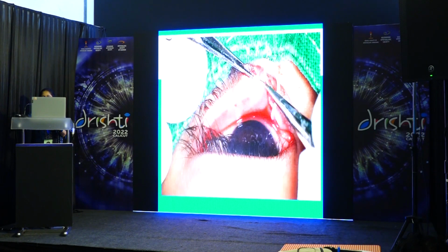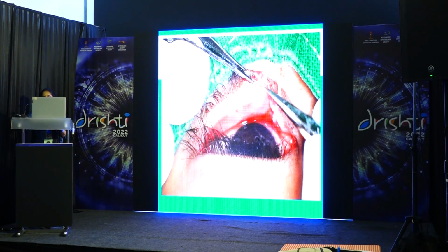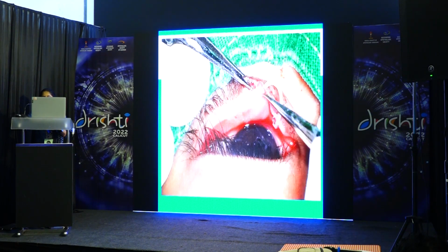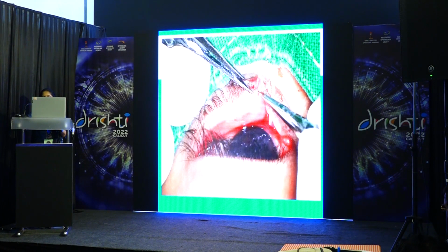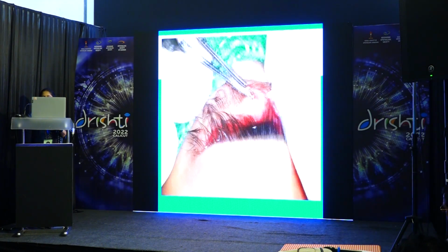If it is very close, sometimes it can cause a punctal tear, so be very careful with that. So what I'm going to do is pull it from the distal end so that I secure it along with the punctum. So this is what I was mentioning.